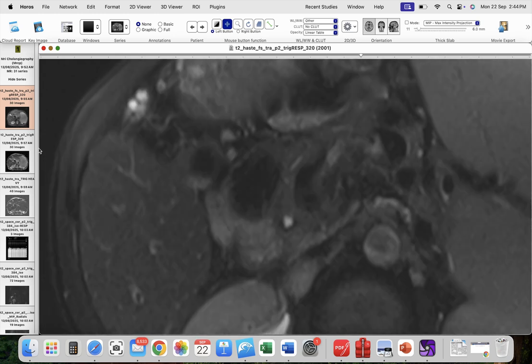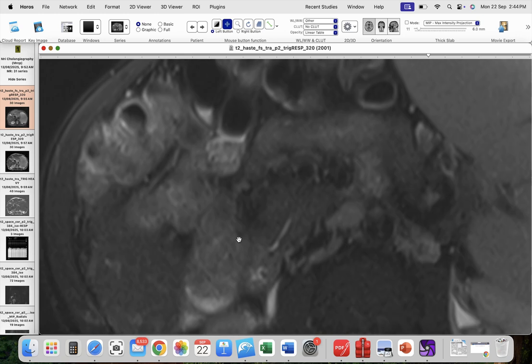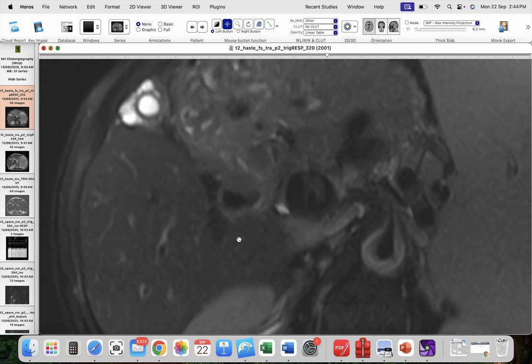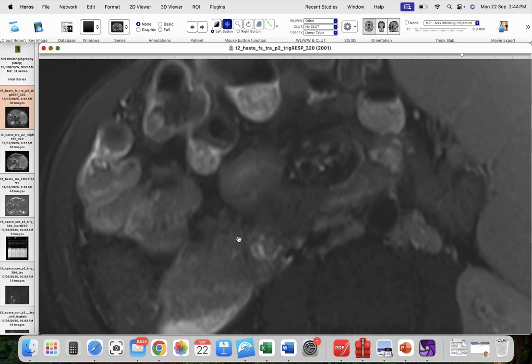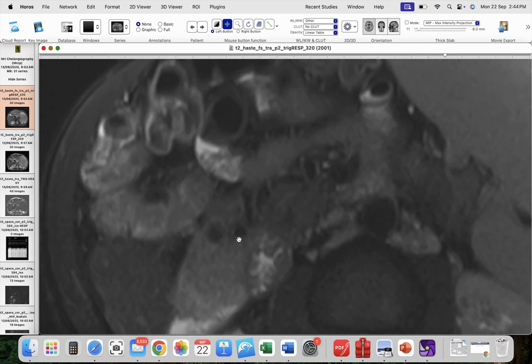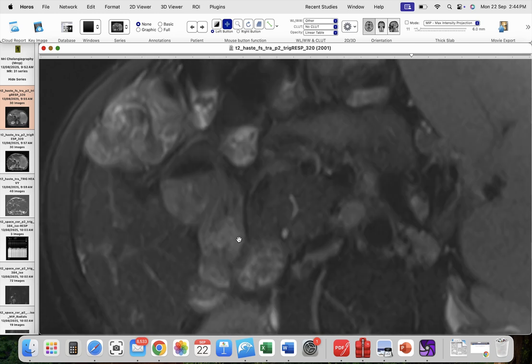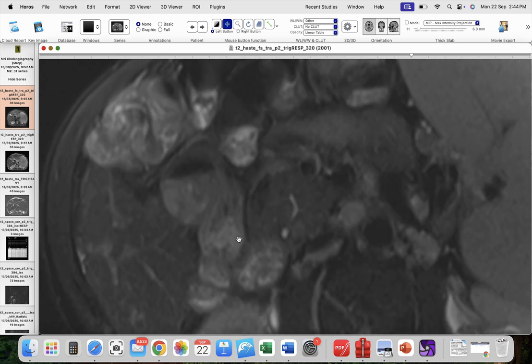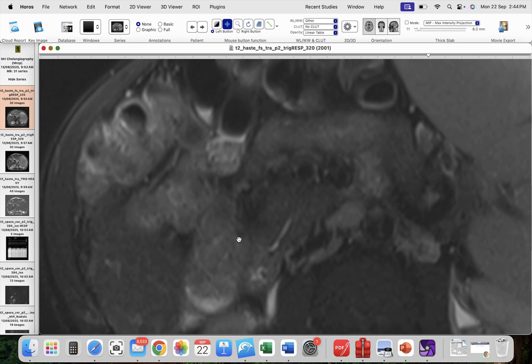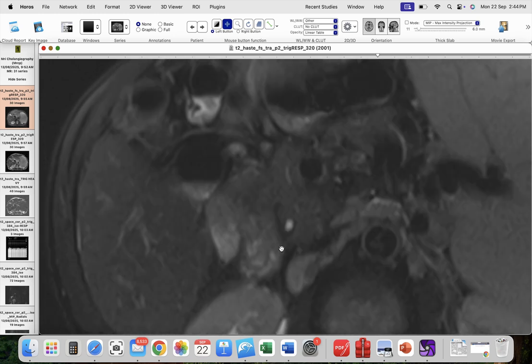It's also useful to always revise the anatomy of the CBD and its junction with the pancreatic duct, because there are some diseases like pancreas divisum which could cause recurrent pancreatitis without the presence of stones. Okay, here there are no stones.